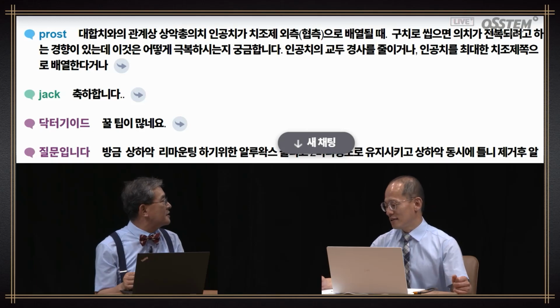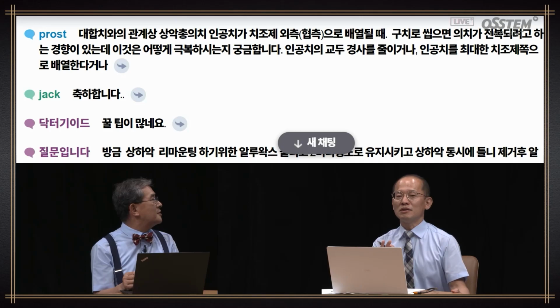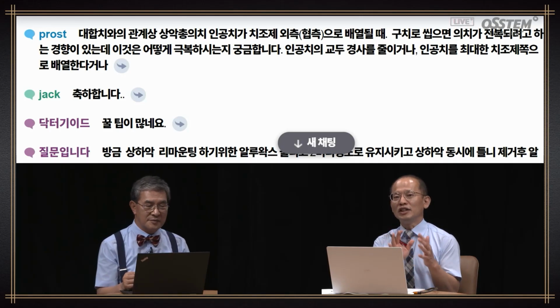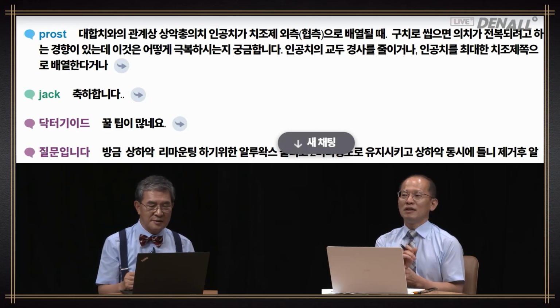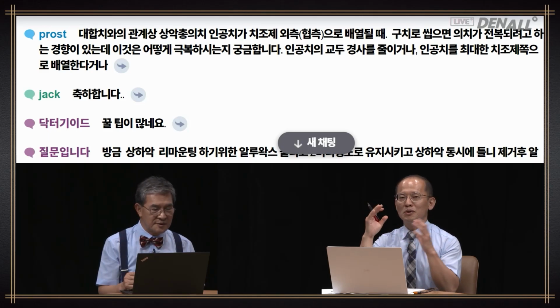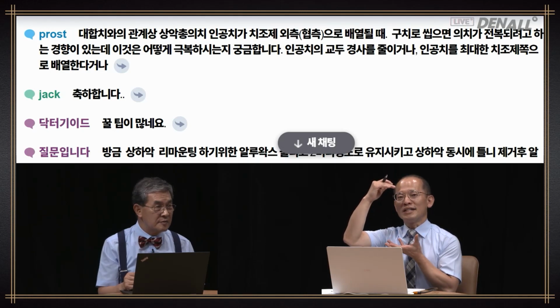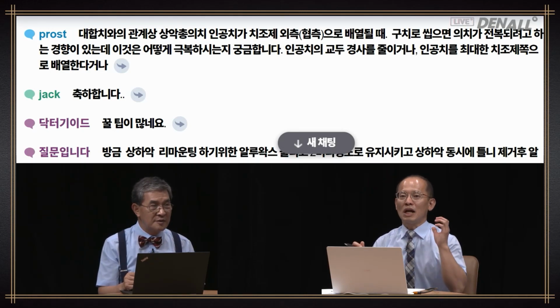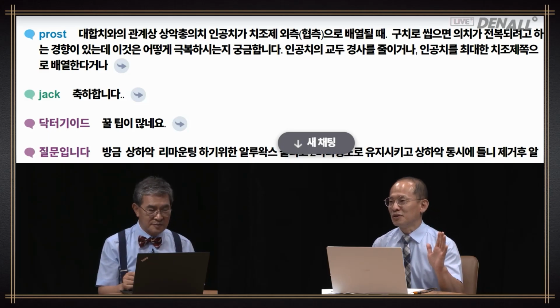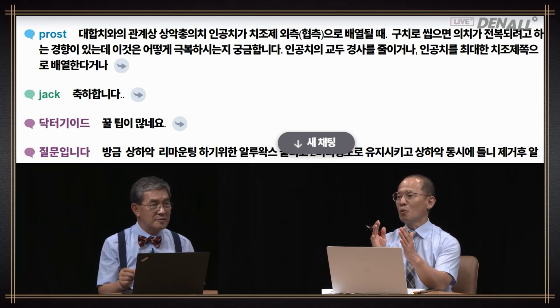Well, that's a good question. I do believe you know the answer because it actually happens fairly frequently. The question itself is very challenging in dentulous opposing patients. It's about the reverse of the resorption. As there's resorption, the mandible becomes bigger and the maxilla becomes smaller. Then the contact mark needs to move to the lingual side.